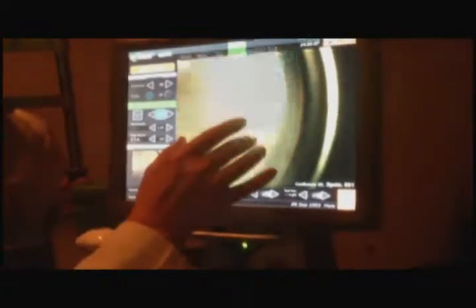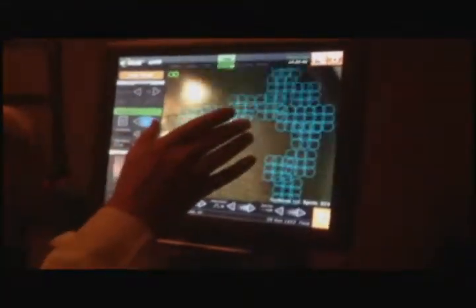As we can see here, we are continuing a very nice pattern. At this portion of the treatment, we are using the touchscreen to preplace our positions. Here, we are lasering the nasal part of the patient's right eye. We can follow the treatments on a TV monitor screen, which is also excellent for educational purposes, whereby other physicians can observe directly as the treatment is ongoing. The green line then captures the images, and these images are automatically saved to the system.